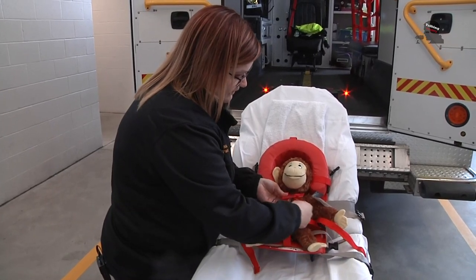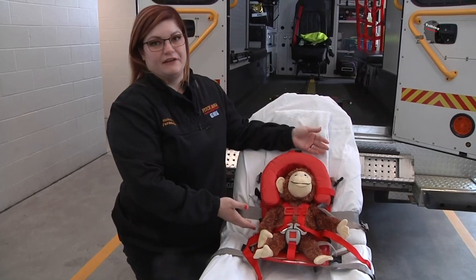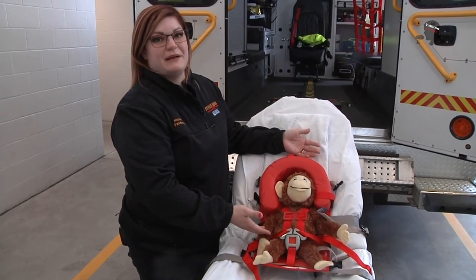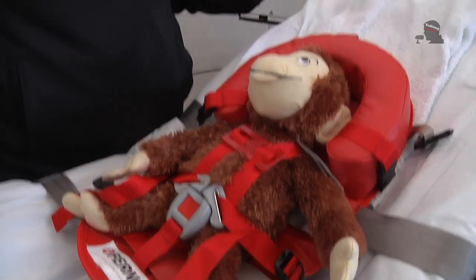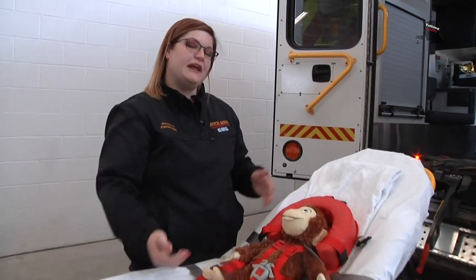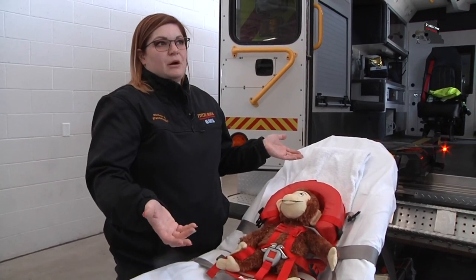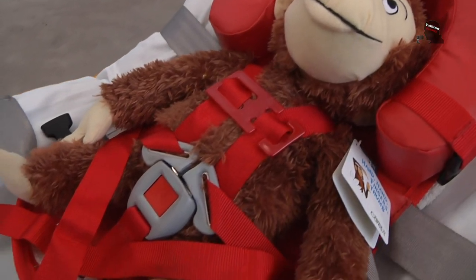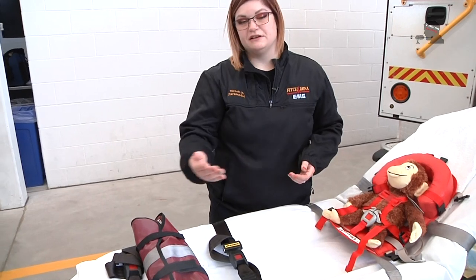And in the event that something were to happen in the ambulance, we would have a crash situation, this would be safest for baby versus being in a car seat because they are secured to the cot with a device made to do so. So that's our NeoMate. Ages as appropriate, weight 5 pounds up to 14. So we could essentially transport a brand new newborn baby up to a baby probably 8 months old in this NeoMate. For babies and children who are greater than 14 pounds, we also have what's called a PediMate.